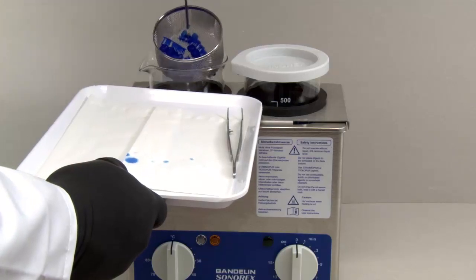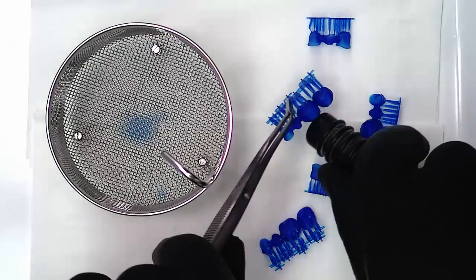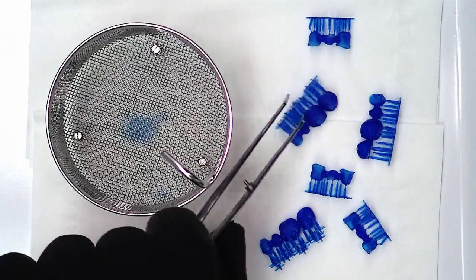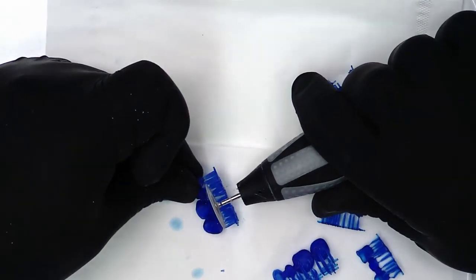Then remove the restorations. Blow away excess isopropanol to dry them. And then simply remove the supports with a separating disc.